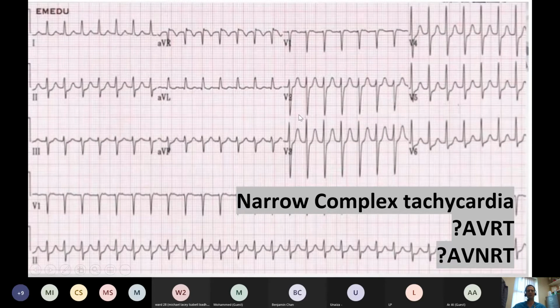It's very useful to get a 12-lead ECG of the termination of this arrhythmia, and adenosine would be the sort of most optimal way of getting the patient out of it. You could also, beta blockers often work very well in terminating these things.